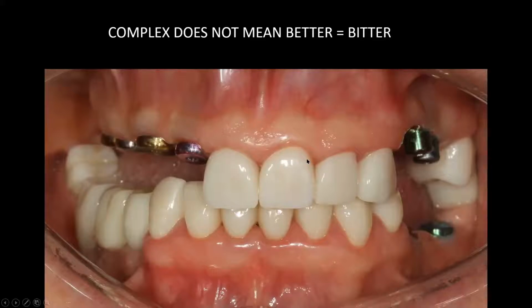Another concern that I have is that these are really heavily zirconia type restorations. I probed these margins, and I'm sure Stan's looking at those things. There are pockets everywhere here, Stan. There are millimeter ledges all around here. You can put your perio probes in. The patient's got a thicker biotype, which compensates at the moment, but you can see all the marginal erythema, can't you, here, Stan?